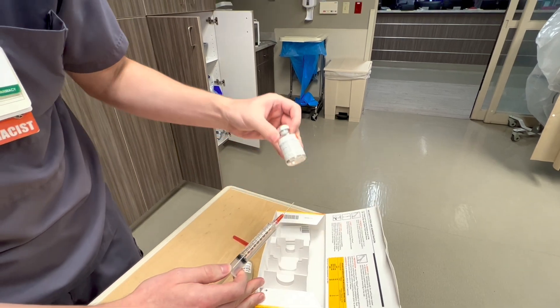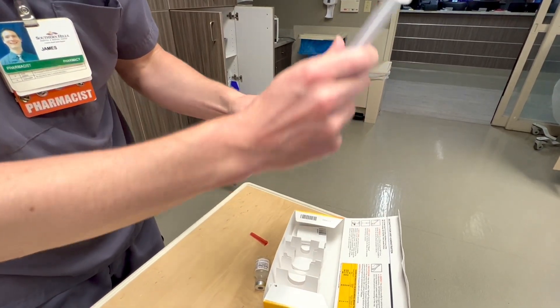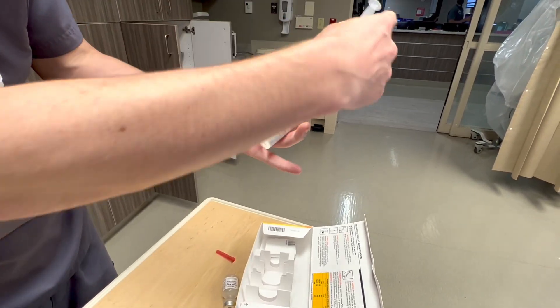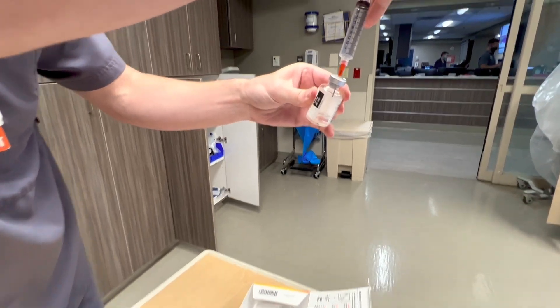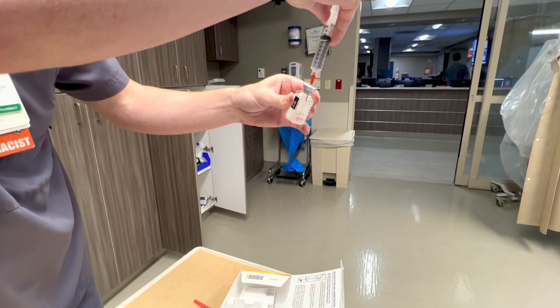Then you'll have your TNK, which is a powder. This one's already been mixed, but you want to avoid getting the diluent directly on the powder. So if you can just angle it so that it drips down the sidewall and slowly go in, you'll put the 10 cc's in.